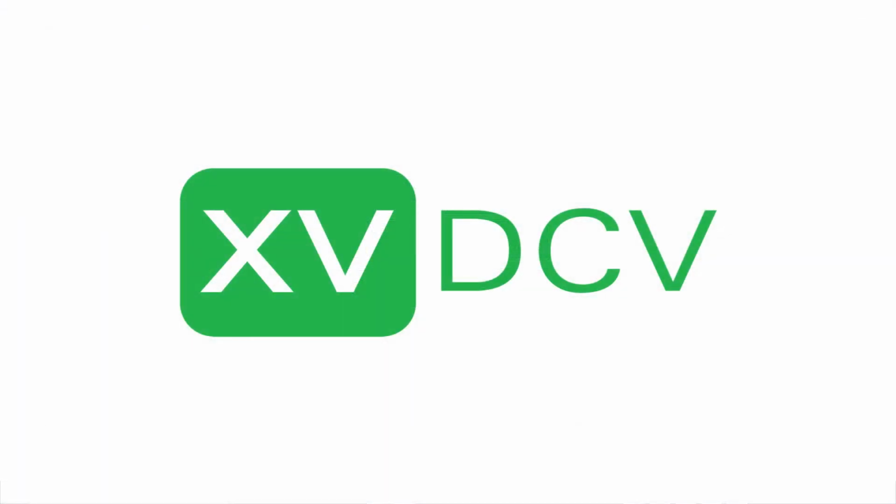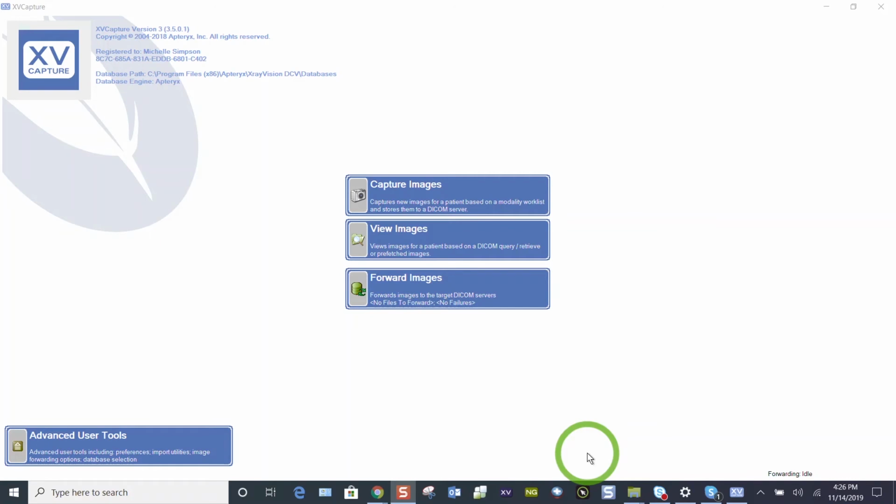This is a tutorial on how to take 4 Bitewings in the XVCapture version, the 3.5 version. You see in the upper left-hand corner, that's your version. How do we get here?